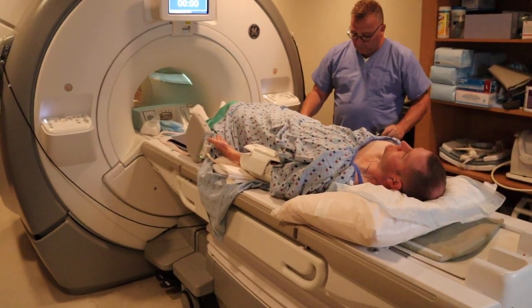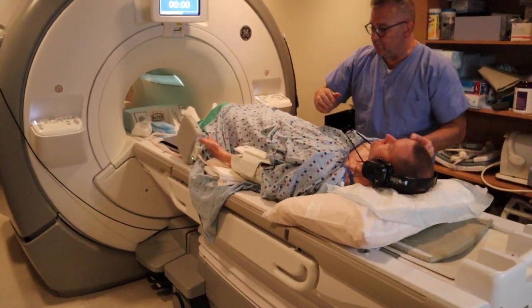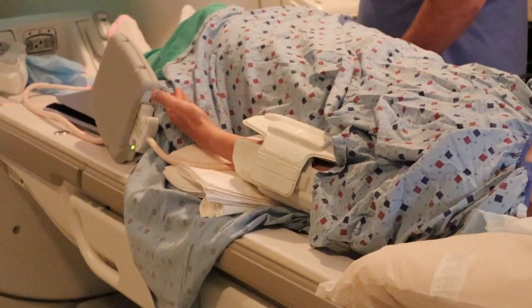Headphones and emergency ball to communicate with the technologist. You want to center dead center in the middle of that coil.